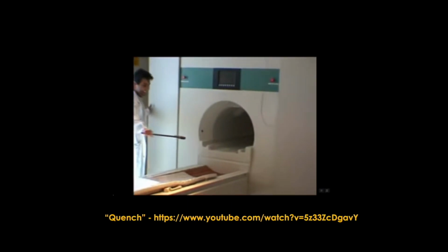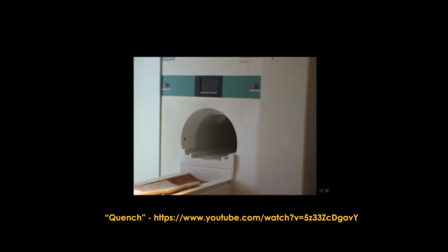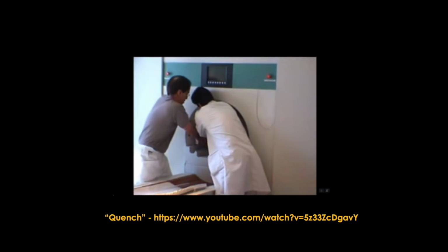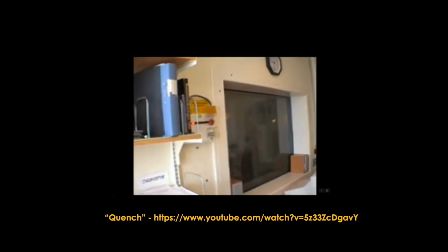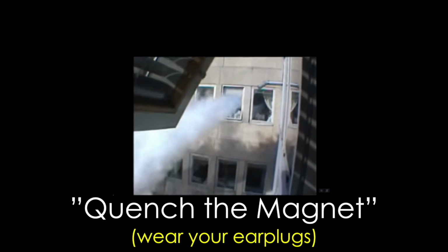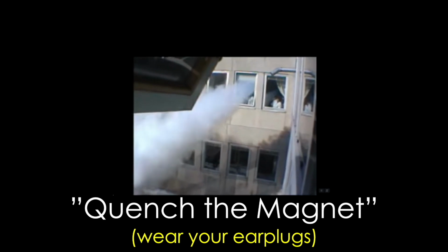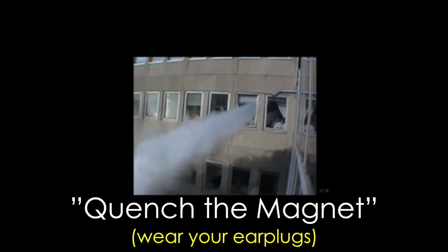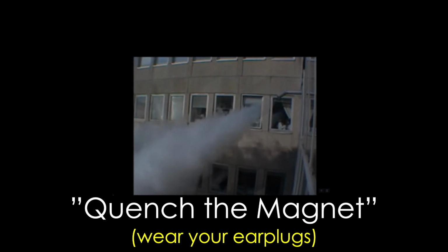You can see just how powerful the magnet is in this clip. And in emergent situations, say someone is pinned inside the MRI machine against one of these metal objects, you may have to do what we call quench the magnet, quickly dumping the coolant which allows the superconductor coil to heat up and lose its magnetic field. But be warned, this is extremely loud and can cause hearing damage, a favorite board testable fact. You'll also want earplugs for when your manager begins yelling at you for the hundreds of thousands of dollars it will cost to recool and recharge the MRI machine.